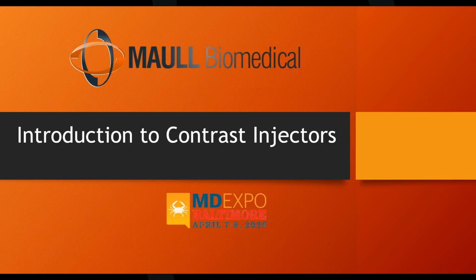All right, now, blood vessels. Blood vessels don't typically show up on X-ray images because blood vessels compared to bone are neither thick nor dense, all right? That's why blood vessels don't typically show up on an X-ray image. Now, most of the time, we don't care. We're here to see if this bone is broken or cracked or whatever. I don't care about the blood vessels, but sometimes we do care about the blood vessels. Sometimes we do want to see them.